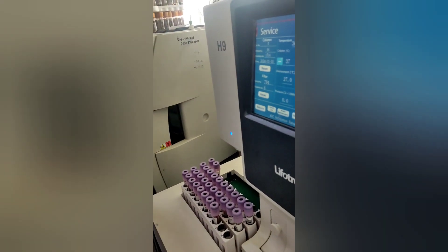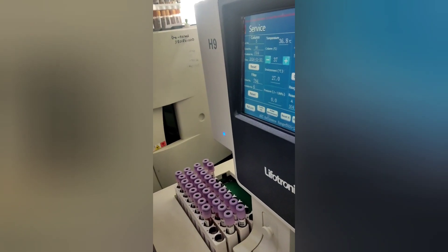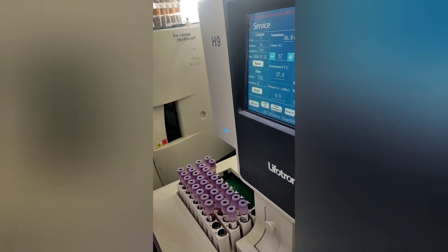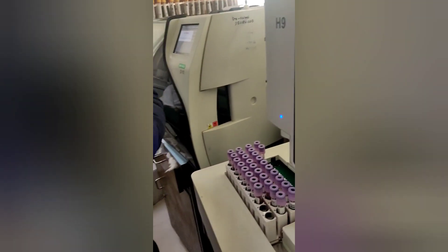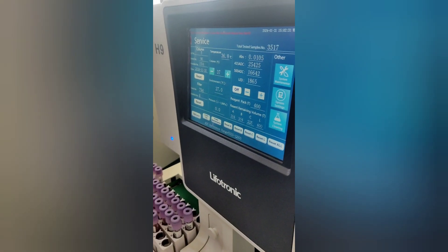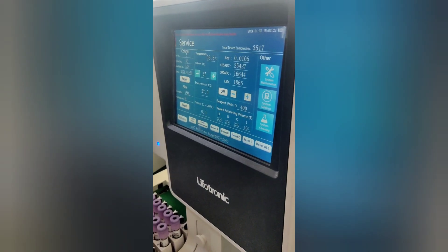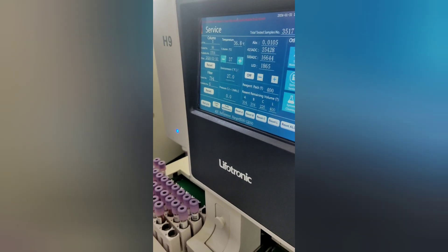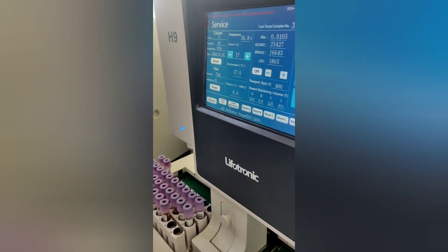Before changing the column, we must reset the column by going into service. We then have to enter the serial number of the column. After a successful reset, it will again display 16,000 tests.